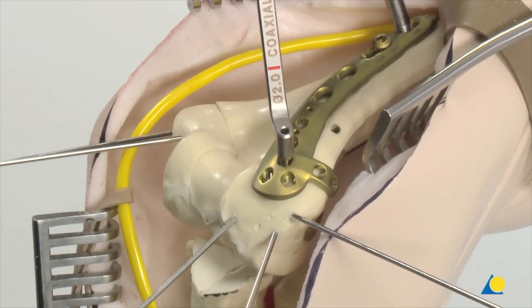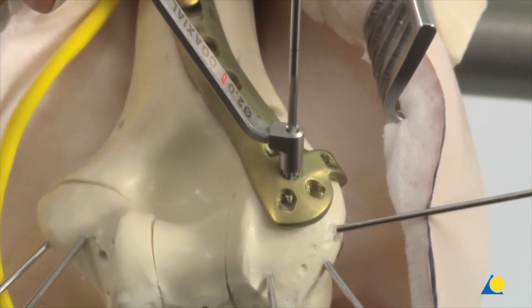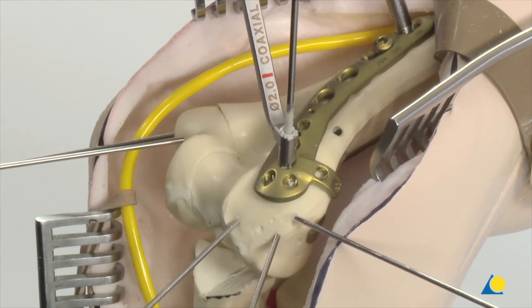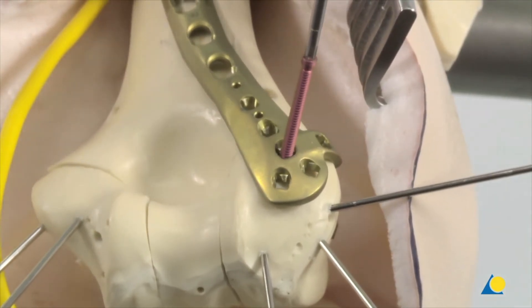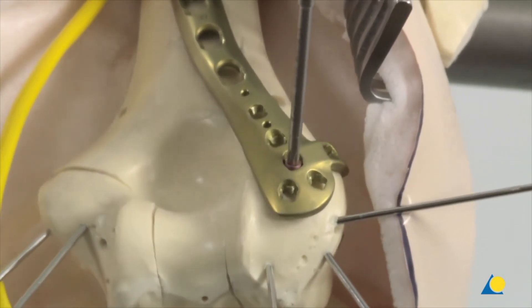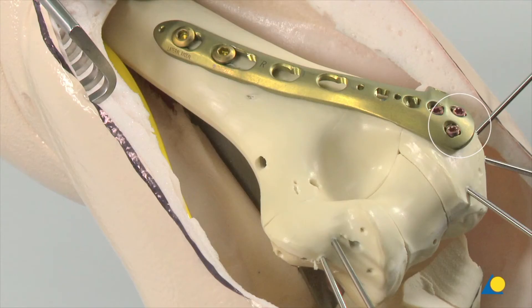Insert the VA-LCP drill sleeve 2.7 into the central variable angle locking hole, ensuring that the drill sleeve tip keys into the cloverleaf portion of the plate hole. Use the 2.0 mm drill bit to drill to the desired depth. The fixed angle end of the drill sleeve ensures that the drill bit follows the nominal trajectory of the locking hole. Remove the drill sleeve and use the depth gauge to measure the screw length. Use the star drive screwdriver shaft to insert the 2.7 mm variable angle locking screw; the 1.2 Nm torque limiter connected to the handle for torque limiters must be used for the last few turns to avoid damaging the threads. Two more variable angle locking screws are inserted in the distal plate holes, and a cortex screw is inserted in the most proximal plate hole.